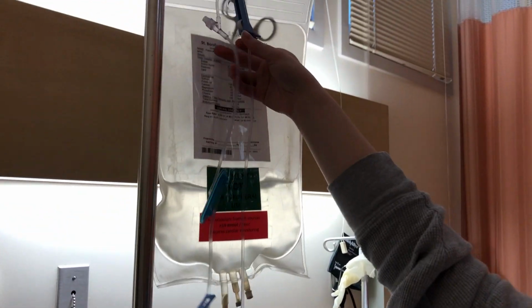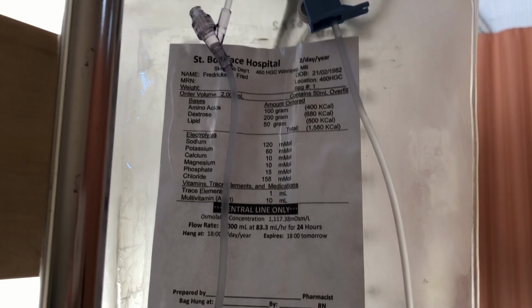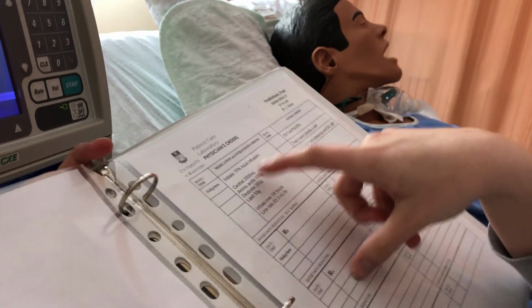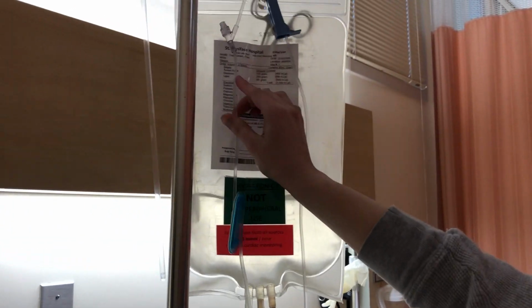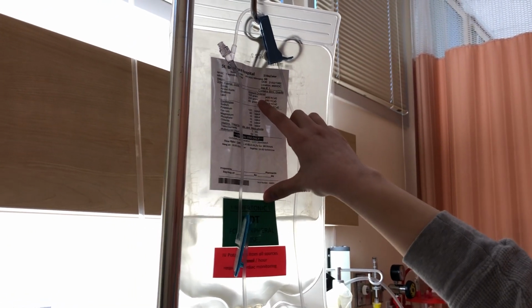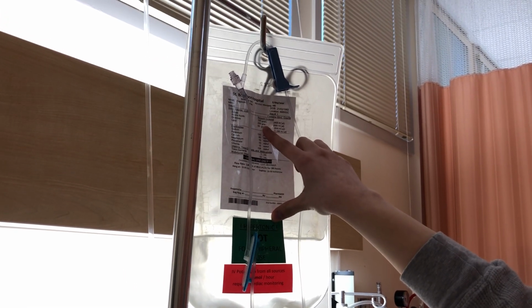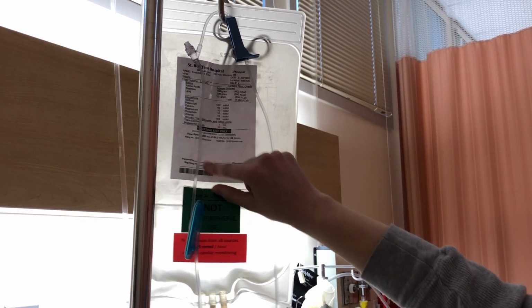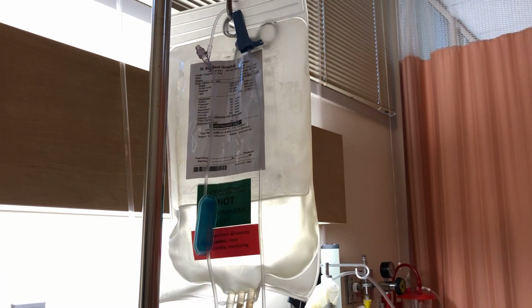I'm checking my bag here. Okay, so my physician order says initiate TPN infusion. There's a 2,000 ml bag for central. So 2,000 ml. Amino acid, 100 grams. So I have 100 grams there. Dextrose, 200 grams. So I have 200 grams. Lipids, 50 grams. I have 50 grams. And this is to infuse over 24 hours. So my line rate is going to be 83.3 mLs per hour.